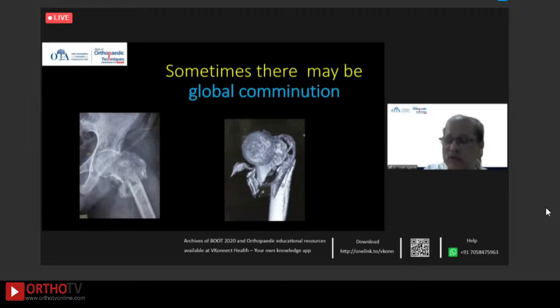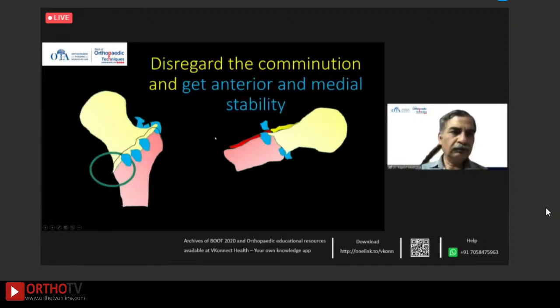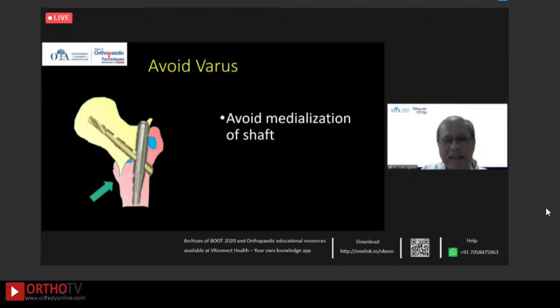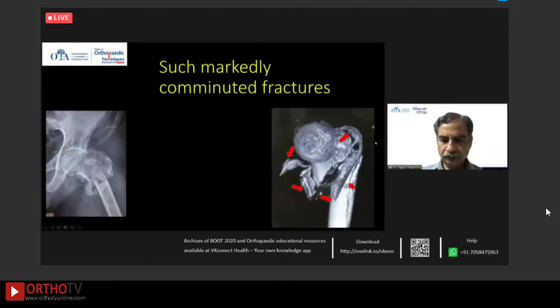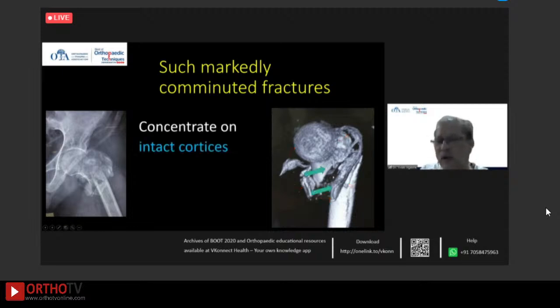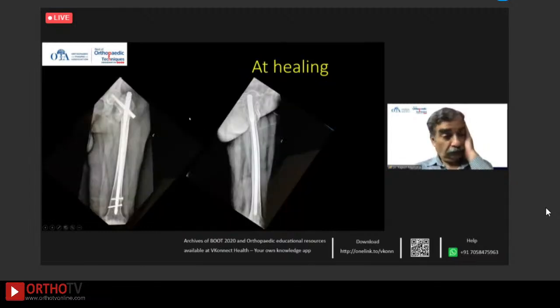Sometimes there is global comminution, as you saw that three cases had global comminution. So here, if there is anterior comminution as well as posterior comminution and medial comminution, then what do you do? The best is to disregard the comminution and get the anterior and medial stability, whatever it is. So avoid varus, avoid medialization of the shaft like this, maintain valgus, and just disregard this entire comminution. Concentrate on intact cortices, whatever you have. So here I concentrated on the intact cortices, disregarded the comminution, and this is at healing.